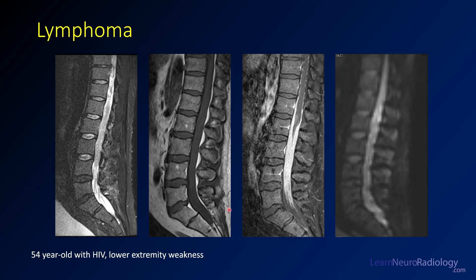This is a case of lymphoma — a 54-year-old with HIV and lower extremity weakness. On T2 with fat saturation, you see irregularity along the cauda equina from about L1 to L4-L5. On T1, the CSF is not as dark as it should be. On post-contrast, this can be incredibly deceptive: there is avid enhancement along all the nerve roots of the cauda equina, so much that it's encasing the conus and almost looks like a T2-weighted image. On DWI, the entire thecal sac has diffusion-restricted material — the tightly packed cellular material from lymphoma.